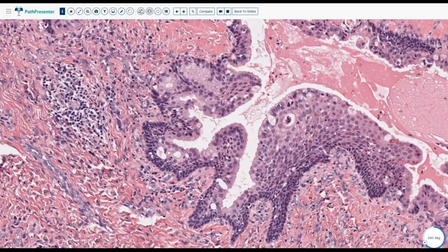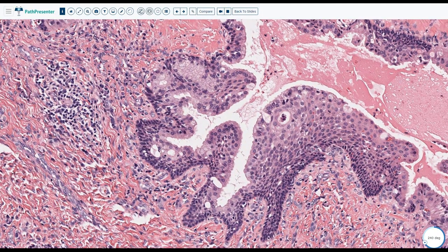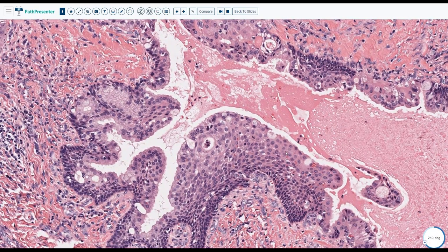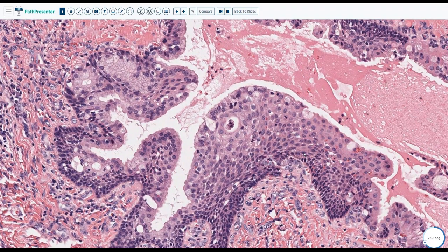So what we have here, anybody like to describe what kind of cells they are? I guess most of you by now know the diagnosis. I see some of you like to use squamoid. Yes, they are squamoid or epidermoid. They like the word epidermoid, and I will soon say why we say epidermoid rather than squamous.